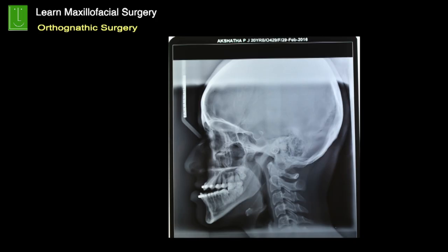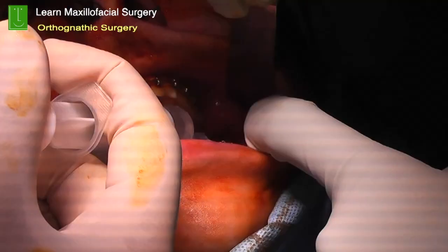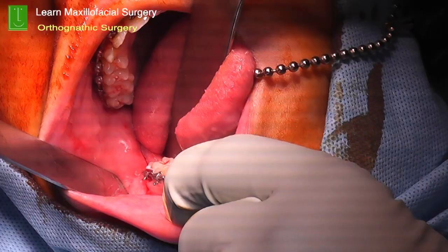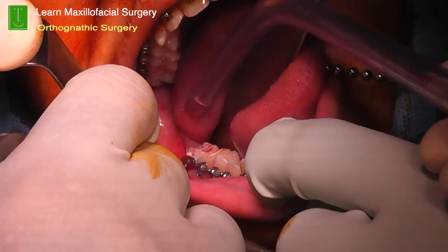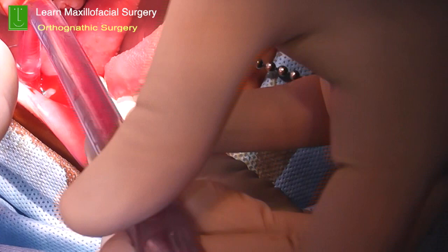A lateral cephalogram helps in analyzing the profile, and in this case the SNB was significantly more, and that's where we had planned for a mandibular bilateral sagittal split osteotomy. Giving local anesthesia into the operative area helps in reducing the bleeding when you're raising the flap. Nasotracheal intubation is mandatory, and the tube can be secured by using a stitch right in front of the nasal septum so that you don't have any tapes and the whole face can be exposed.